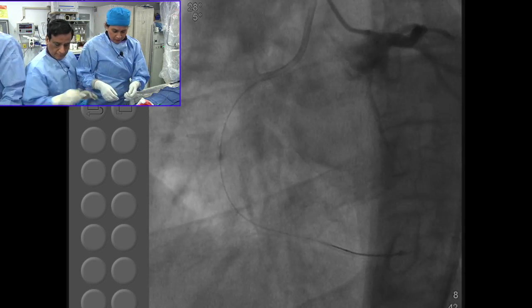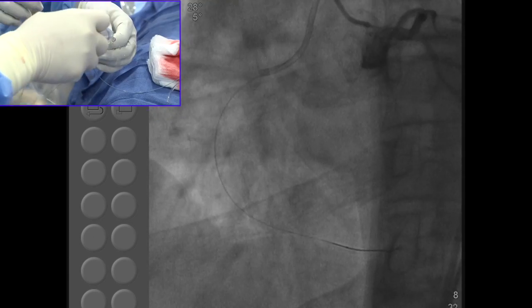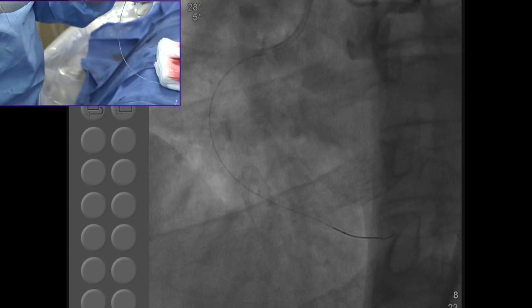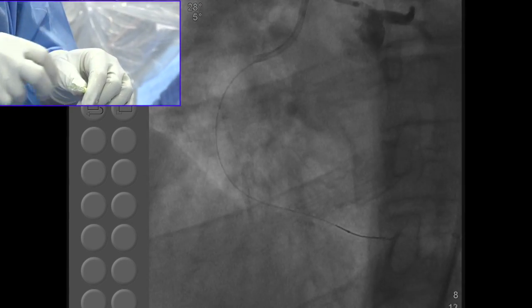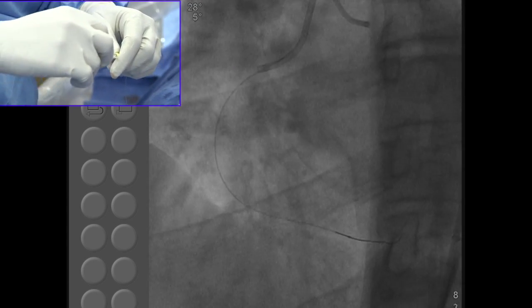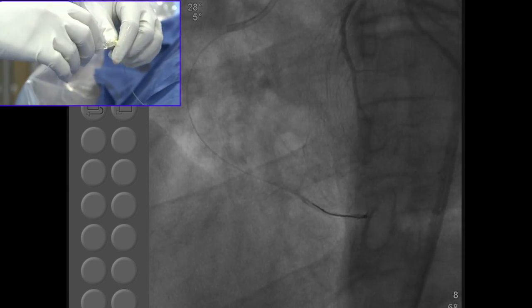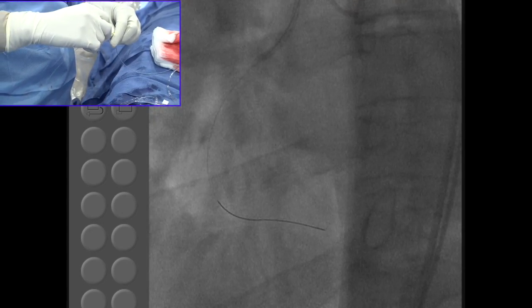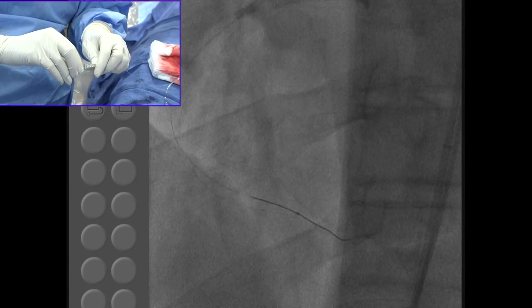20 high pressure. So are you going to use the same wire or switch it for...? No, we are just going to use a 300 wire now, since the transit catheter crossed. If the Fine Cross or an over-the-wire balloon did not cross, then you need to take that out and probably try a smaller balloon, of which 1.2 is the smallest, and these were the balloons also tried in EXPERT CTO, the Mini Trek balloon. So exactly the same strategies which you employed in the trial.